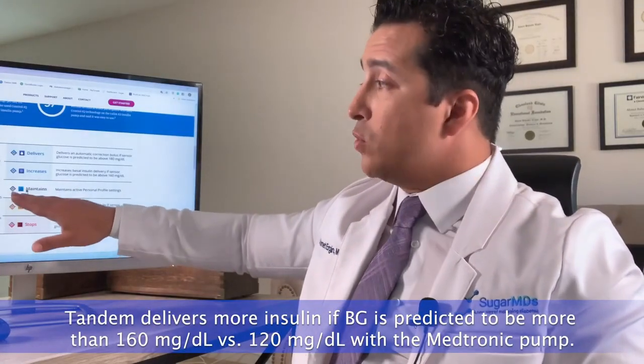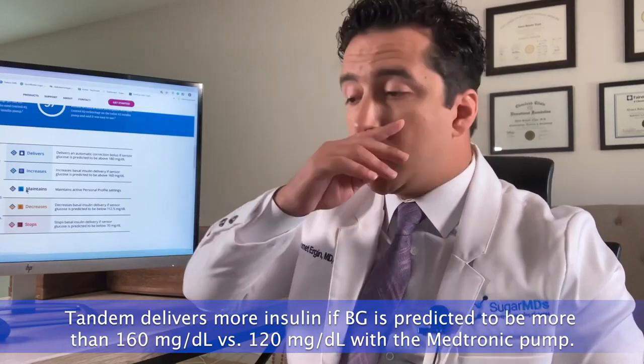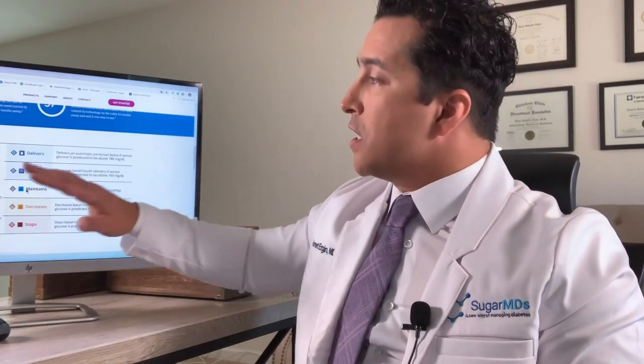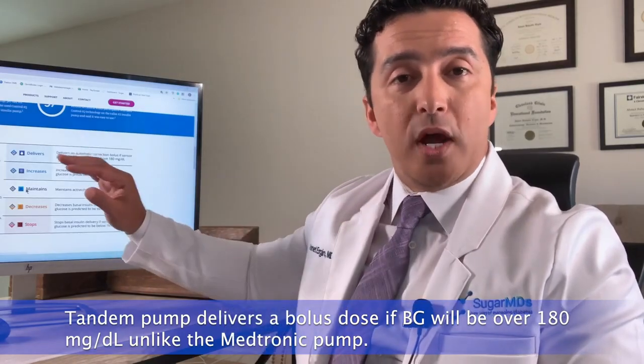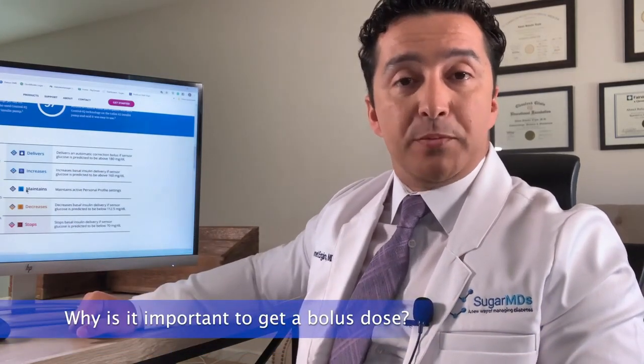The Tandem pump will give you more insulin if it predicts your blood sugar will exceed 160 mg/dL, whereas Medtronic acts above 120. So Medtronic tries to keep you in a narrower range around 120 mg/dL. With Tandem, unless the predicted blood sugar is above 160, you won't get extra insulin. Importantly, Tandem will give you an automatic correction bolus if your blood sugar is predicted to exceed 180 mg/dL — something the Medtronic pump does not do.